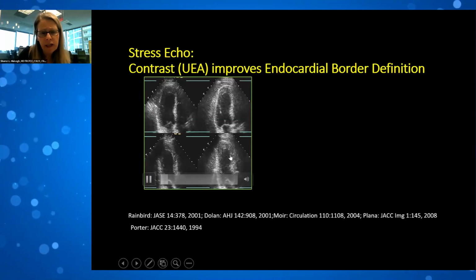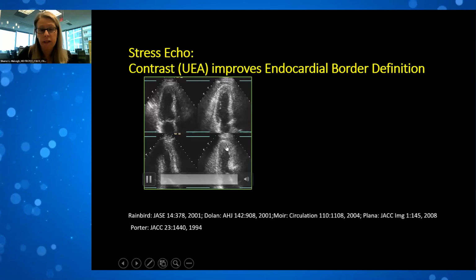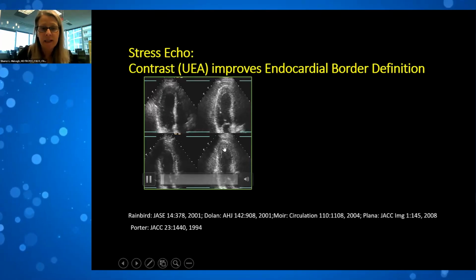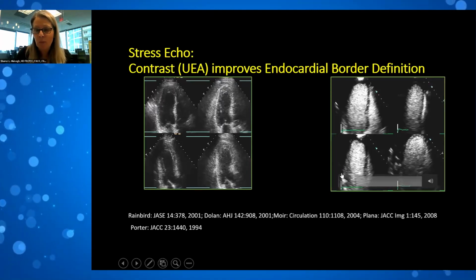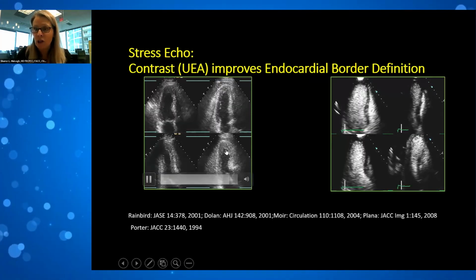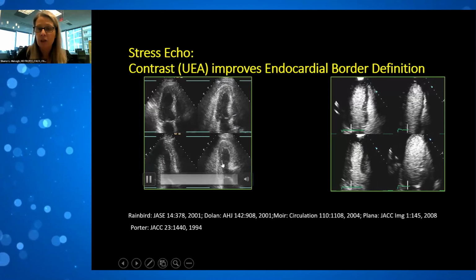And if you look carefully, you have to be very suspicious about the anteroseptal region here. And the other thing you notice is that the myocardium looks very thick at the apex. Well, this patient does not have left ventricular apical hypertrophy. No, what this patient had was poor endocardial visualization, lack of complete endocardial visualization because these images are foreshortened.